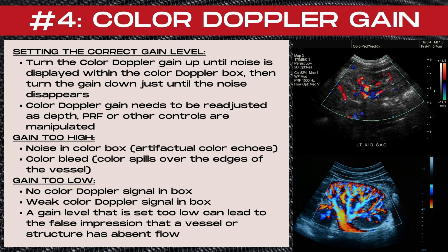Note that this color Doppler gain level will need to be readjusted as depth, PRF, and other controls are manipulated. If the color Doppler gain is too high, you'll see noise in the color box — artifactual color echoes that don't represent actual Doppler information — and you'll also notice color bleed, where color spills over the edges of a vessel. If the color Doppler gain is too low, there will be no or very weak color Doppler signal within the box, and a gain level set too low can also lead to the false impression that a vessel has absent flow. Setting the correct color Doppler gain is one of the most essential things you do when first using Doppler.